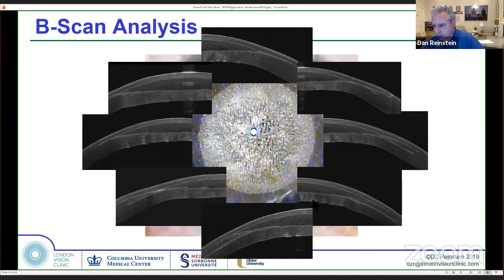And by the way, look at the stromal edema, right? Because I've just taken them out of the operating room, okay? And we're gonna go now to the vertical. And now we see the lenticule, but we see that there is a sort of a V-shaped lip here. So we see that my instrument punched into this false plane here, because cornea is soft, especially down there at a 250 micron level, because it's a minus 11 patient, by the way, in a study.